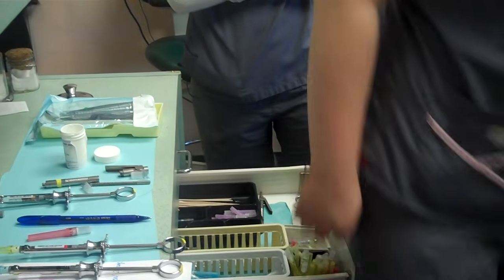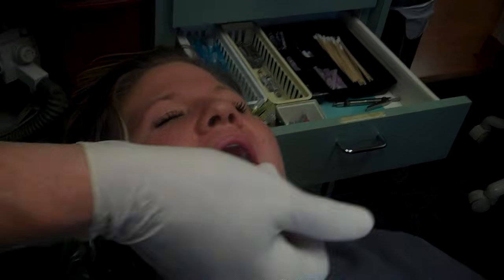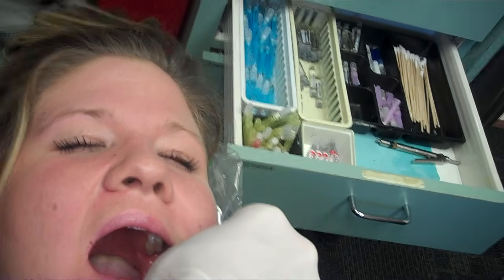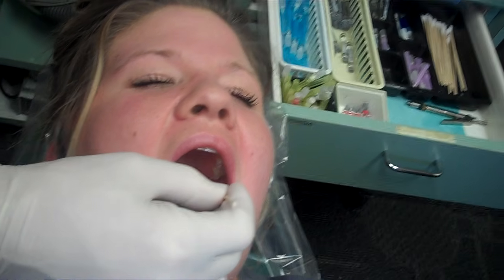So, April, hop in the chair here. I will not block you, I promise, but I will show people how we would typically do this. So if you'll come around here, put the camera here. If I'm going to do a block for April, the first thing I'm going to do is get my topical and place it. Thank you, April, open really big. Now, here's where I'm giving my injection on the lower. This is how I figure it out. I feel back here till I feel the edge of her jaw, and then where my thumb is, we go halfway through there and 1.5 centimeters back. So I know I'm going to give the shot right there. I'm going to place my topical right there, and then I'm going to cover it up like that, and we're going to let that set.